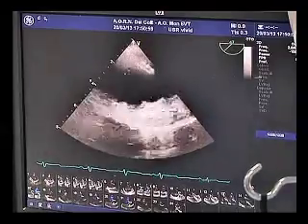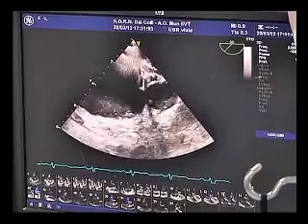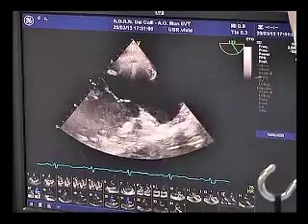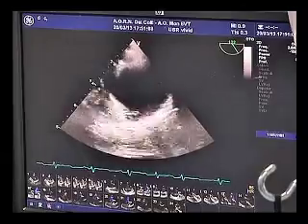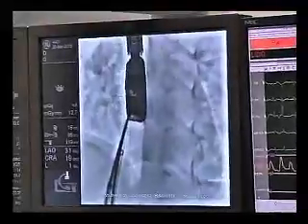So we have to try to check if the position is good, if it's stable in position before.